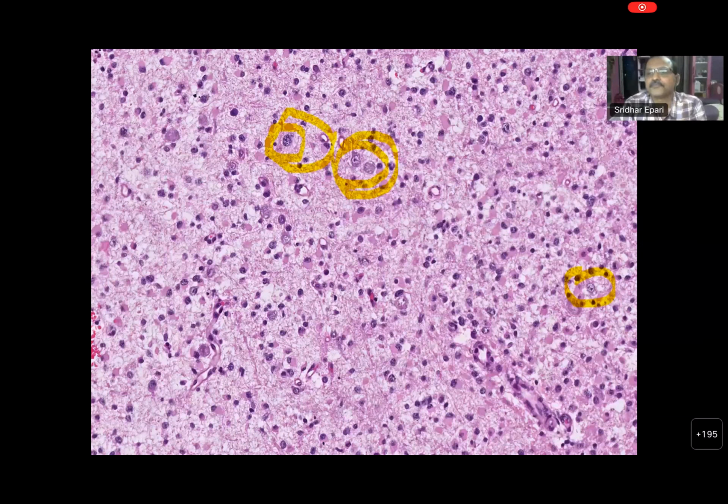There is a little bit of gray area about the number of mitosis required for an astrocytic tumor for upgrading it. There are various thought processes, but I can tell you simplistically, in a slide, if you find 2 or more mitosis, it is significant to upgrade it to grade 3. Less than 2 is probably doubtful. So that's for histological grading. After you see the cellularity and all, you need to comment about mitosis.